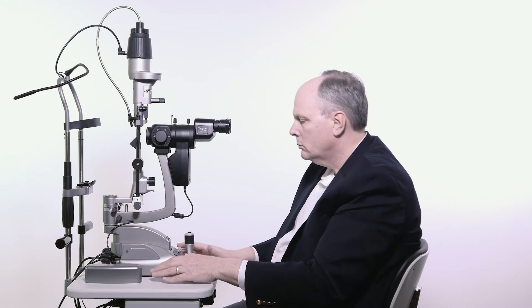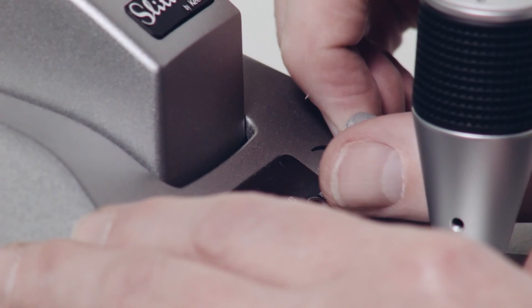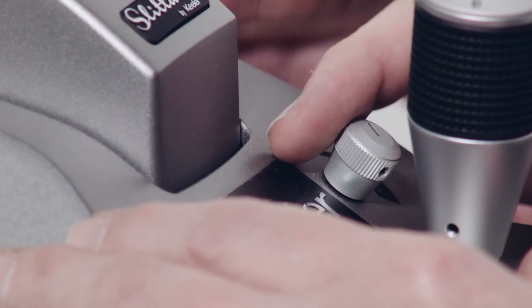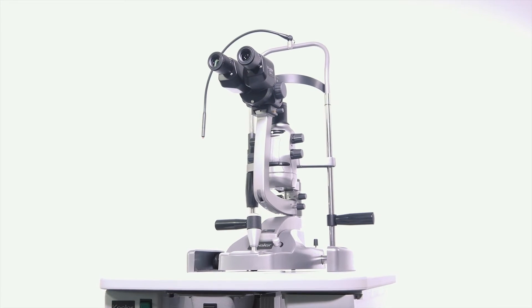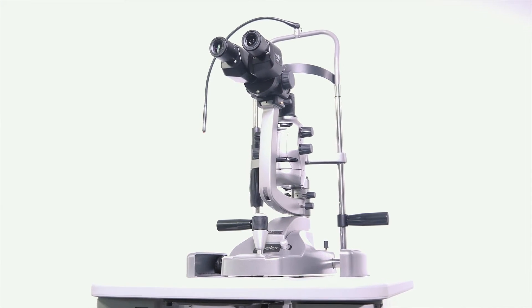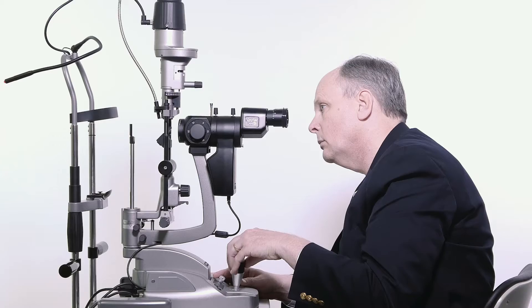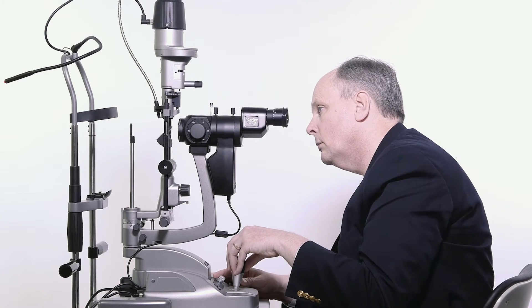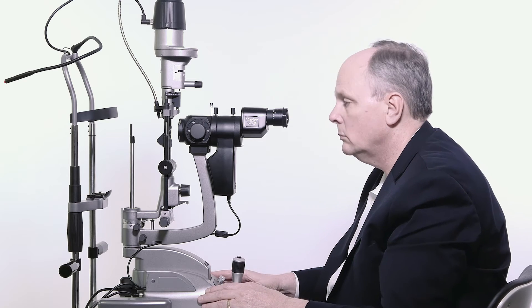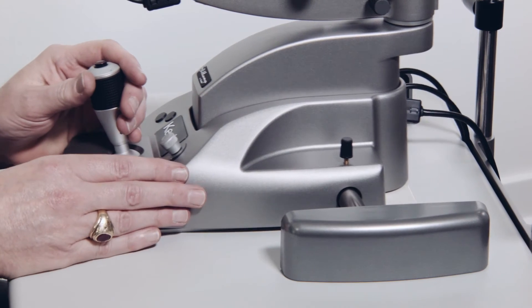Switch on illumination using the main power switch. Adjust illumination using the rheostat near the joystick. The Q series slit lamp offers LED illumination. Rotate the joystick until the light beam is at eye level. Move the slit lamp towards the patient until the slit beam is focused on the cornea.